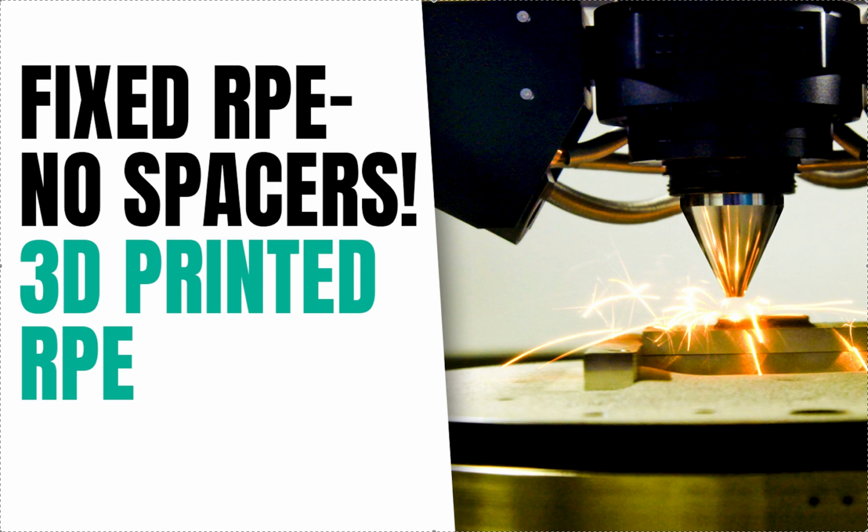I don't have a picture of the actual expander. I've asked a few labs if they can send me a sample, none yet. But basically these metal 3D printed expanders don't require any spacers. So they're very slim. Before, if you wanted a bonded or a fixed expander that didn't sit in between the teeth, it had to have a lot of acrylic on it, which was always a caries issue. These are very streamlined. In my blog, there'll be a link to some journal articles that have pictures of them. But it's basically very thin.